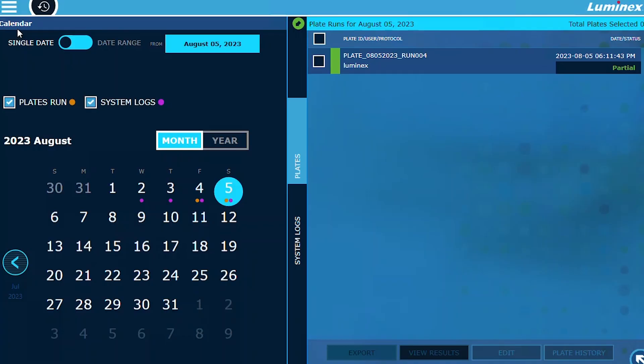History Page. Edit slash replay. With Version 2.0, you can edit previously acquired plates and digitally reacquire them under modified parameters. For exponent users, this is known as replay.